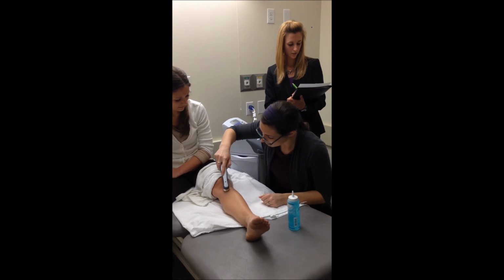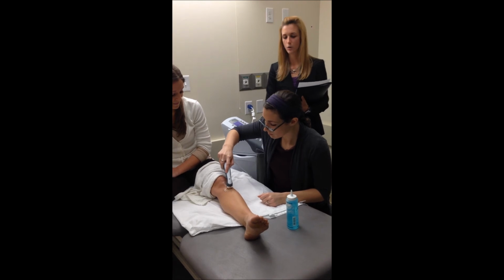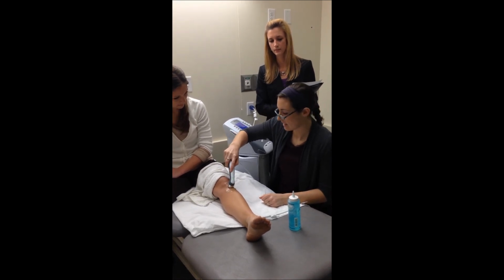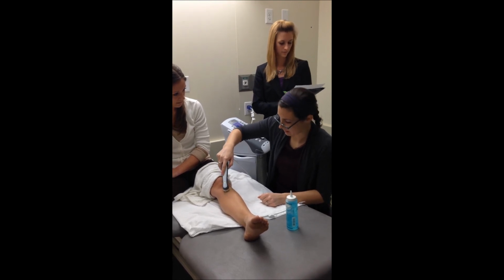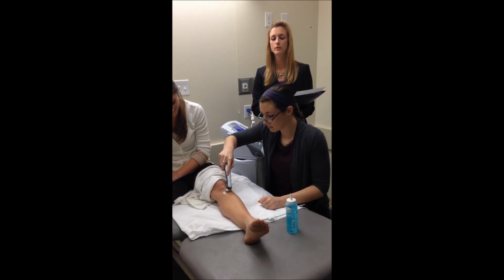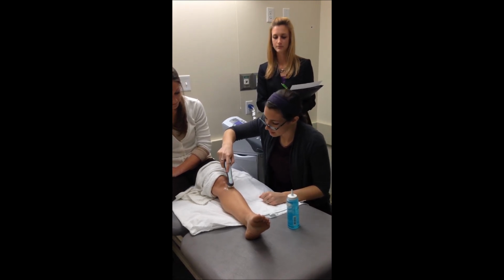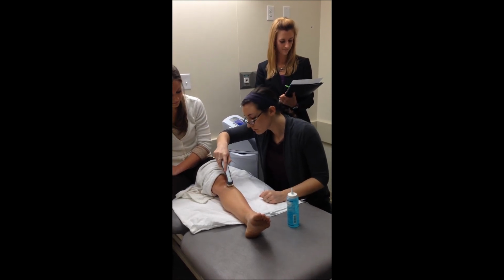Okay, Rhonda, can you tell me a scenario where you would stop ultrasound? Well, I mean, if she was going to kick me in the face, she was probably in a lot of pain, I'd probably stop. Okay. I don't want to get kicked in the face. Okay. And what is a reason why you would do it on the patellar tendon? Well, you're a runner, aren't you? I think she's having a lot of pain, that patellofemoral pain.